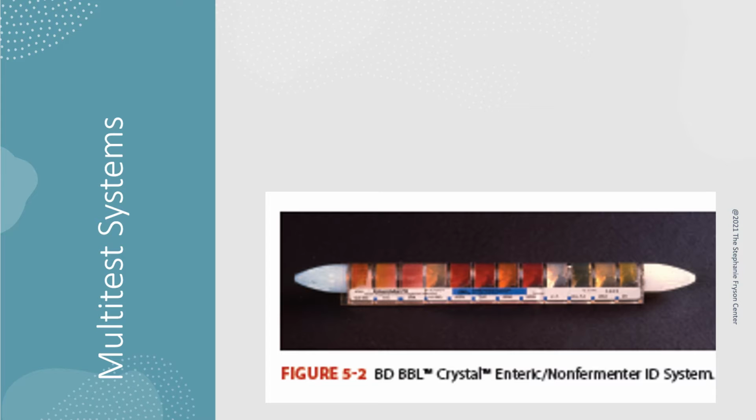Here's what the BD BBL Crystal looks like. See, it's kind of similar, but not exactly, but there's color changes going on here.